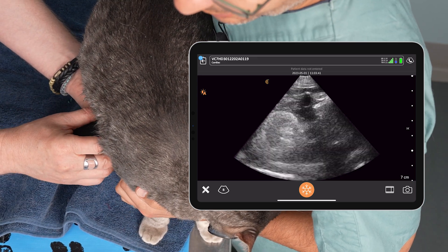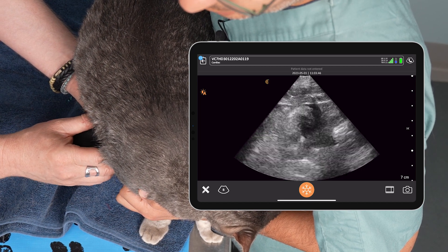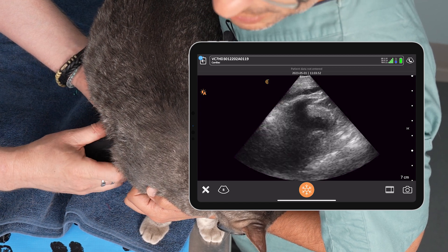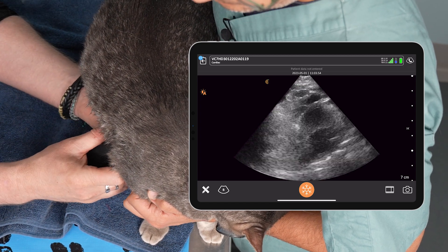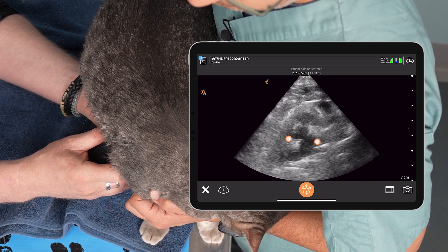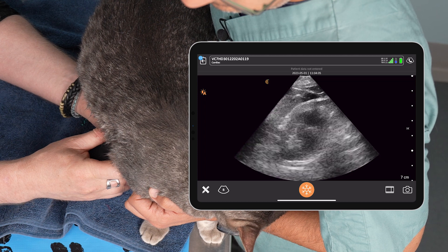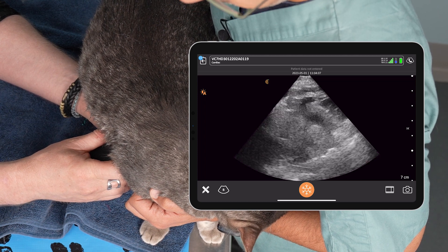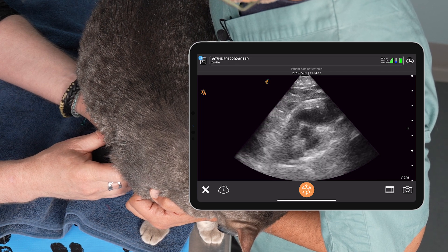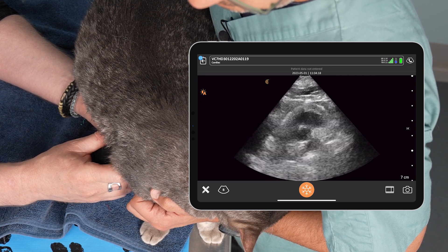Marker towards the elbow and there we go — we get the fish mouth, we get the mushroom. With cats, most of the time as soon as you see the heart you fan and you should get your LAO. There's my aorta, you can see a bit of the valve coming in, and there's my left atrium. Come down just a little bit and we get the fish mouth, and down to the mushroom. Up a little more and there's our LAO with the Mercedes sign — and the whale, that's our left atrium and aorta.